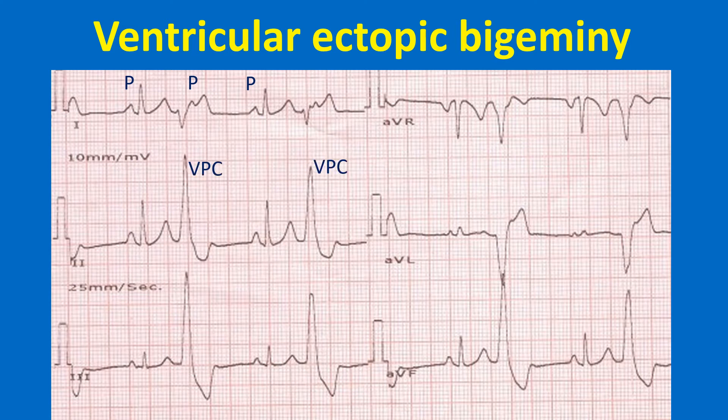In this tracing, P waves are seen as distortions in the contour of the ST segment of the ectopic beat. The distortion is exactly midway between the preceding and succeeding P waves of the sinus beats, which are of narrow QRS. Ventricular ectopics are characterized by wide, bizarre complexes which are premature and not usually preceded by P waves.